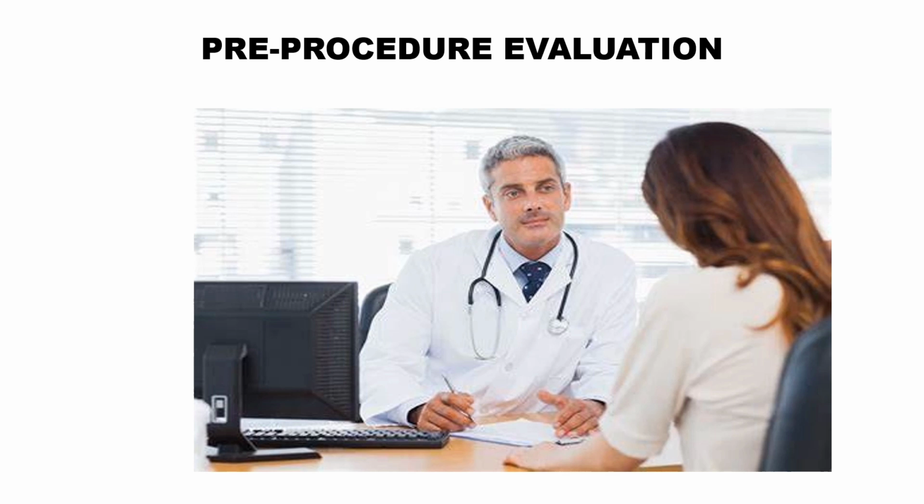What is pre-procedure evaluation? Prior to the line placement, the patient will meet with the physician and supporting staff to explain the procedure and evaluate any special conditions that may affect tube placement. It is important that you tell them if you have had any previous central lines in the neck or arm, any previous line infections, radiation and skin infections, bleeding problems, or any allergies like antibiotics, dye, lidocaine. So all these histories we have to inform the physician beforehand.